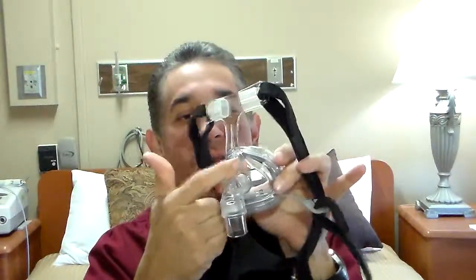Hi, Gabe from CPAP TV. This is from Fisher & Paykel — this is the Zest Plus. It's a wider cut design, and the diffuser is built into the plastic on the mask.